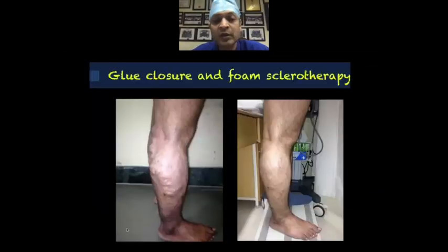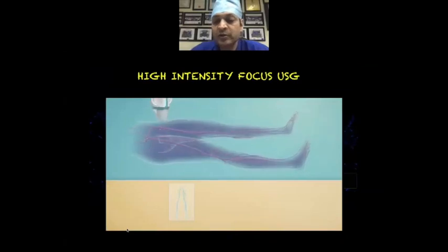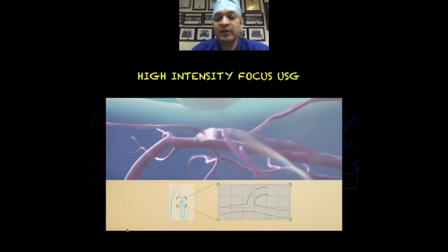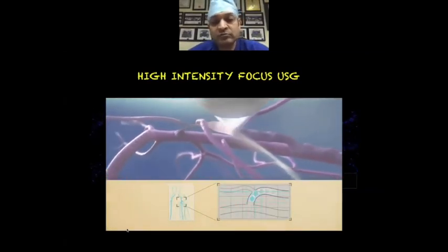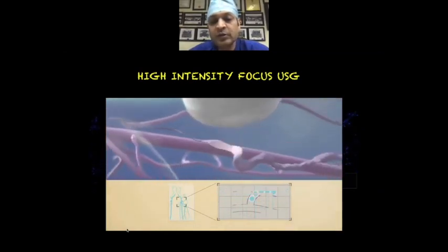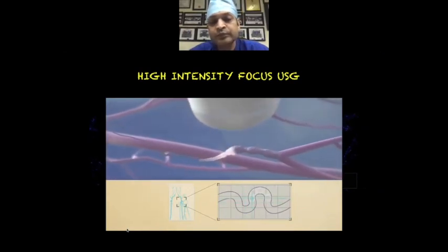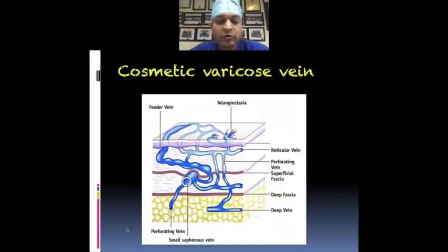Just one of the examples here. High intensity focused ultrasound is another technique where the positioning is controlled via the system. It is being evaluated now to see if it can be safely applied, eliminating the risk of stump formation after treatment. Thanks to its non-invasive character, the beam can follow virtually any path, even tortuous veins, regardless of whether big or small.